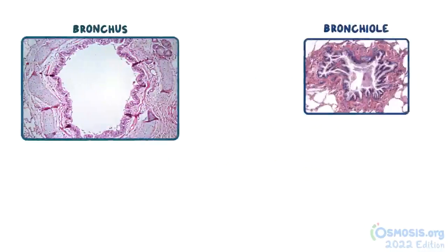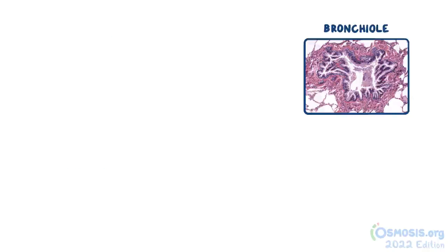If we compare images from a bronchus and bronchiole at low magnification, we can see that the larger bronchi has large supporting cartilage plates that are not seen in the smaller bronchiole. The bronchi also contain seromucous glands that are not present in bronchioles, but the bronchioles will still have a surrounding layer of smooth muscle present. The larger proximal bronchioles, similar to the one in this image, are called the primary bronchioles.